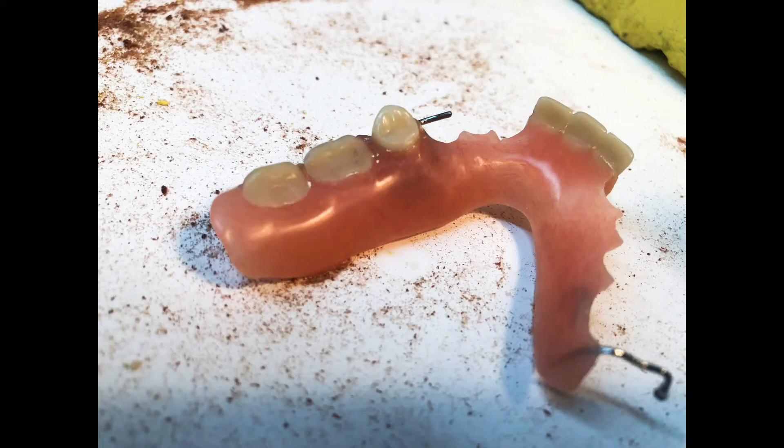Hey, what's up you guys? I just finished a partial. I added a tooth and a clasp to it and had to cut off an existing clasp to move it forward. And I just wanted to do a quick video to show you guys about polishing and some of the common mistakes made. So let's jump straight in.